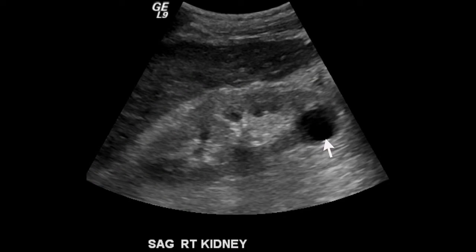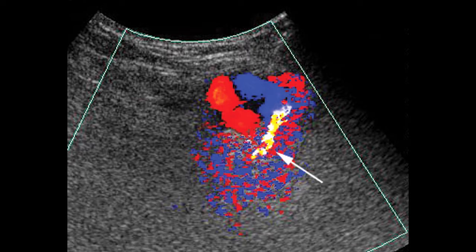There are a few aunt minnies in addition to the things we just talked about. One example that comes to mind quickly is what we call a pseudoaneurysm. If you have a defect but not a complete defect in a blood vessel wall — usually in an artery — when we turn on the color flow, it creates a yin-yang sign where blood is flowing in and back out. Instead of blood flow going in one direction, represented by red or blue on our color display, you have blood coming in and going right back out, creating a swirling effect. That creates a yin-yang appearance on our ultrasound color flow images, and that is essentially an aunt minnie — pathognomonic for a pseudoaneurysm coming off of an artery.